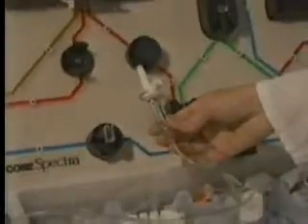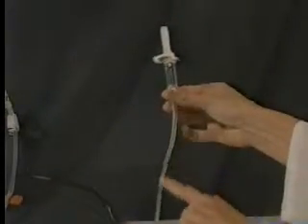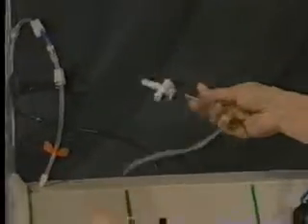Next, remove the access saline line. The access saline line has a green stripe and a drip chamber connected to it. Place the access saline line over the top of the spectra system.